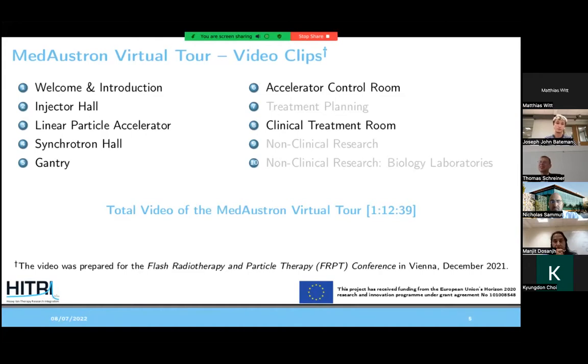Thank you very much. Then the question afterwards: did it reduce the time you need for the commissioning? It is already in operation, but this doesn't mean that we have commissioned all the angles which we want to have. We have currently, I think, three angles commissioned. So there is quite a lot of additional work to do, and we want to have additional ones. For that, the idea is that we can do this now much faster, having this possibility with the rotator. But this will come up in the next months.